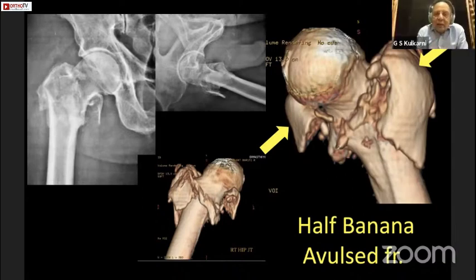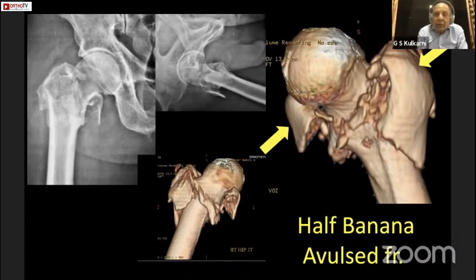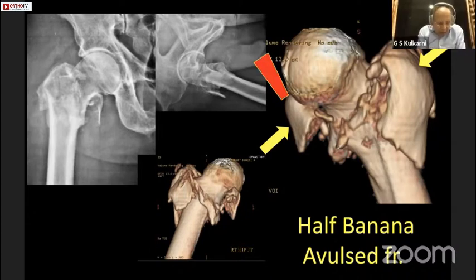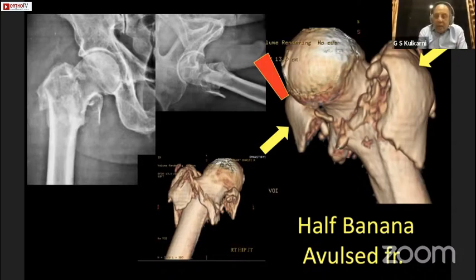Okay, I agree, Shiva. That's a good point. Negative reduction. Yeah, negative reduction. I agree, this must have failed. I think again, I have my objection. We are all seeing day 1 X-rays. We need a 6 months X-ray. I have shown you many cases. Most of them. Some of them. We need the X-ray. I have been arguing this with Shiva also, with Sushrut also. We show them day 1 X-ray, but we don't show a 6 months X-ray or 4 months X-ray. Then I think we do not learn anything. I'm sorry, Govind. Please proceed. I will show you innumerable X-rays, sir.